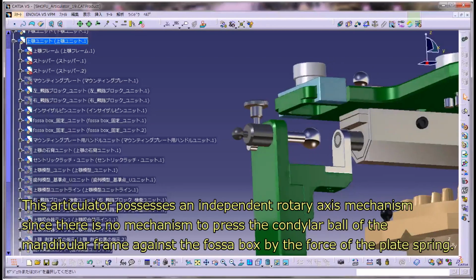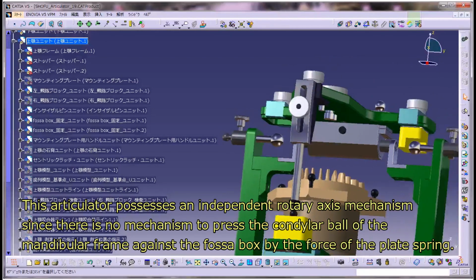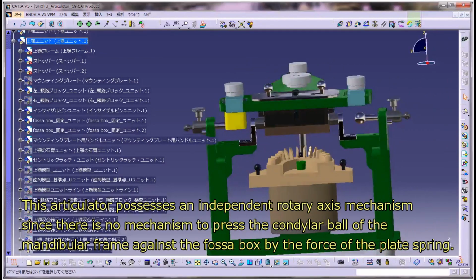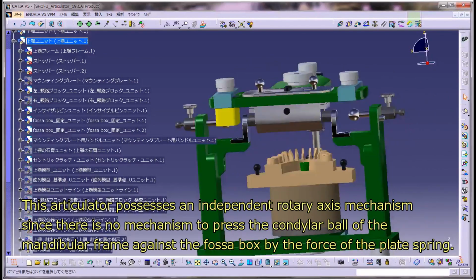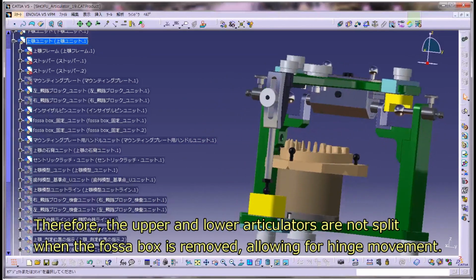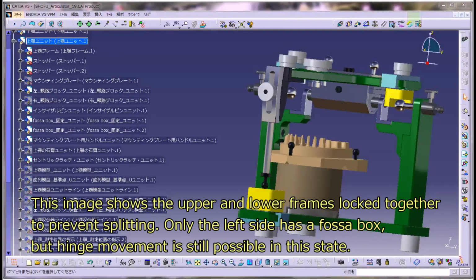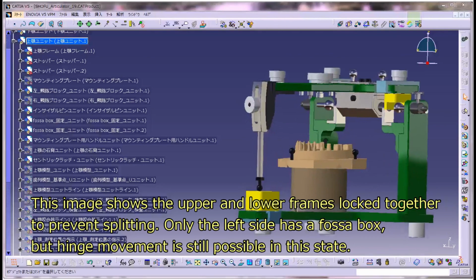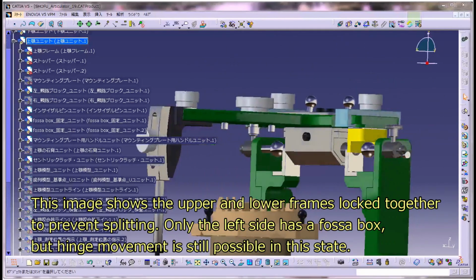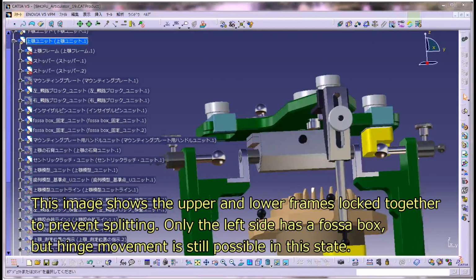This articulator possesses an independent rotary axis mechanism since there is no mechanism to press the condylar ball of the mandibular frame against the fossa box by the force of the plate spring. Therefore, the upper and lower articulators are not split when the fossa box is removed, allowing for hinge movement. This image shows the upper and lower frames locked together to prevent splitting. Only the left side has a fossa box, but hinge movement is still possible in this state.